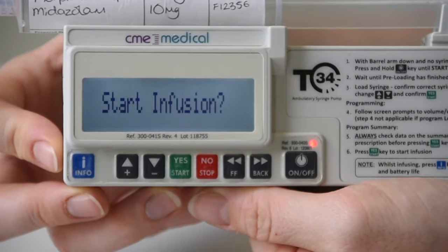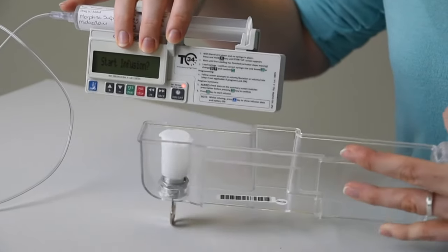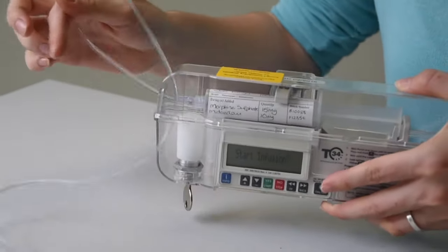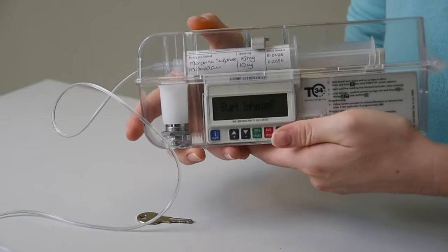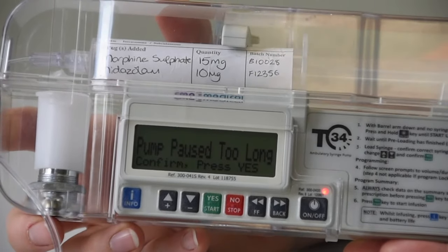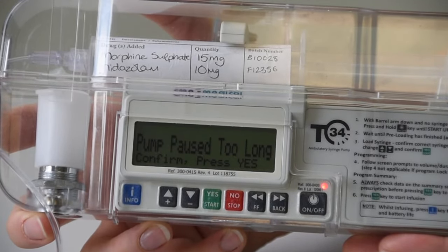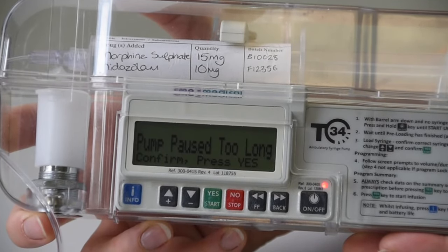Once ready to bring the pump to the patient, place the syringe pump into the locked box as shown and lock with the key. The control buttons will still be accessible with the locked box in place. You may see a pump pause too long message appear on the screen. The pump will alarm and the red light will come on. This is normal and it's simply an alert to make sure the pump is attended to.